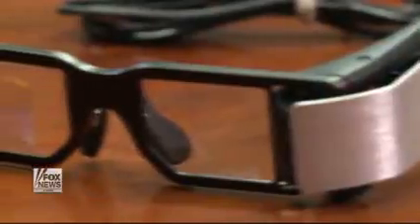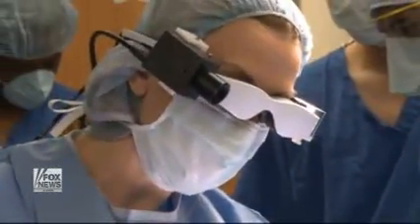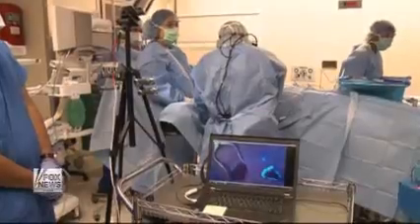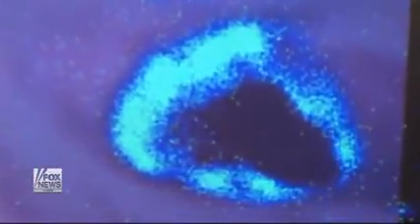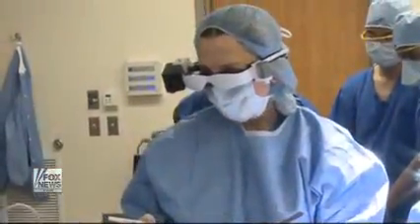Fear gave way to hope when Seguido learned her surgeon would be wearing special eyewear during her operation. It's like, wow, we have Superman glasses. The Superman glasses, known simply as cancer goggles, work with an infrared light that helps doctors see cancer when a patient's malignant tumors are injected with a dye, which makes them glow. What the goggles are really doing is they're helping me see the fluorescence that we've marked or tagged to a specific marker that is taken up by the cancer cells.